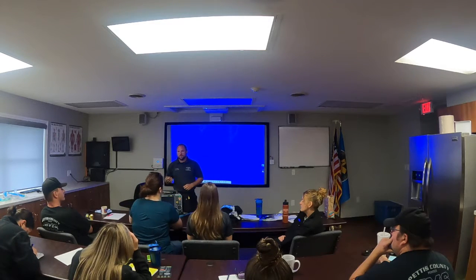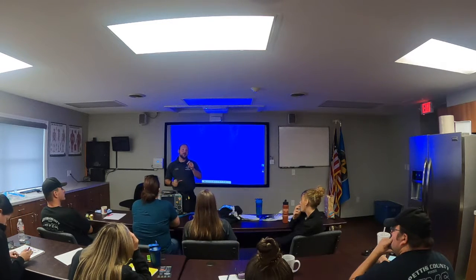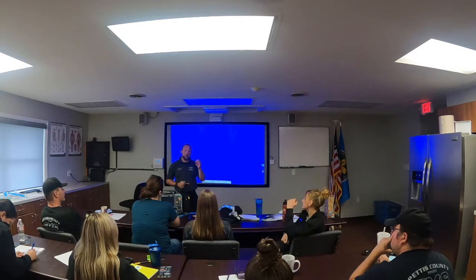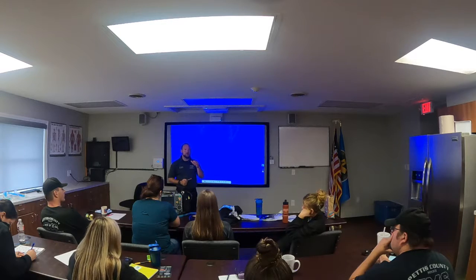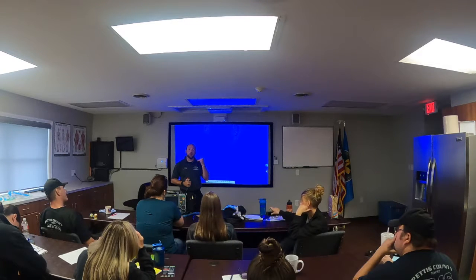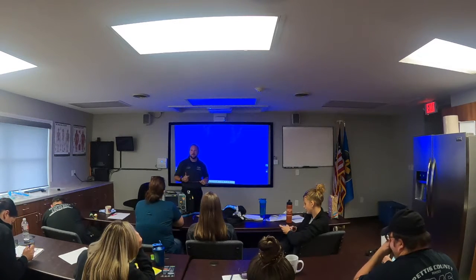Yeah. They should have a filter on your patients, and that's going to throw it off a little bit also. There will be some variations, especially when it comes to your end tidal. The volumes delivered, whether by volume or pressure, won't be terribly different, but depending on where it's at, your end tidals are going to be slightly different from what you're actually doing. Just know dead space would probably be increased as well because of that filter, but not by much. So it shouldn't be terribly much of a difference with how you set up your patient on your vent with that filter added on.